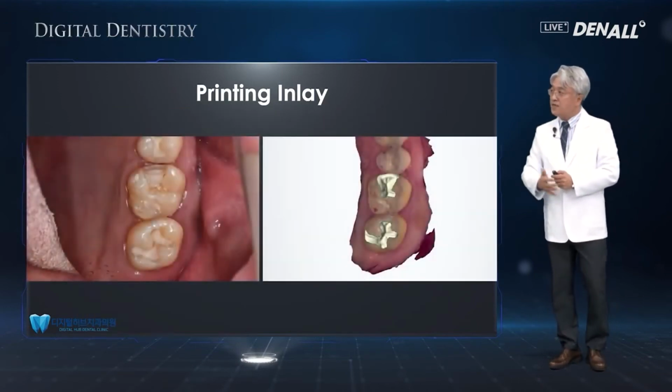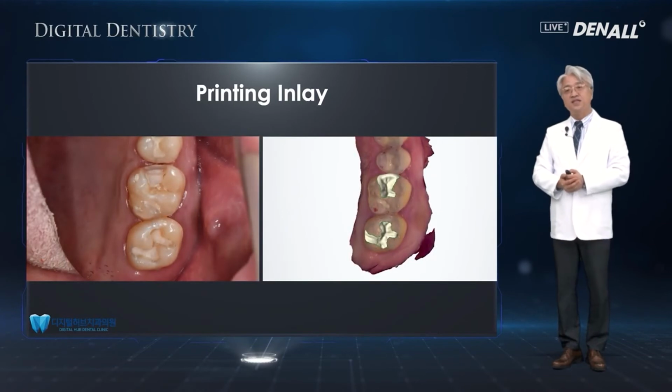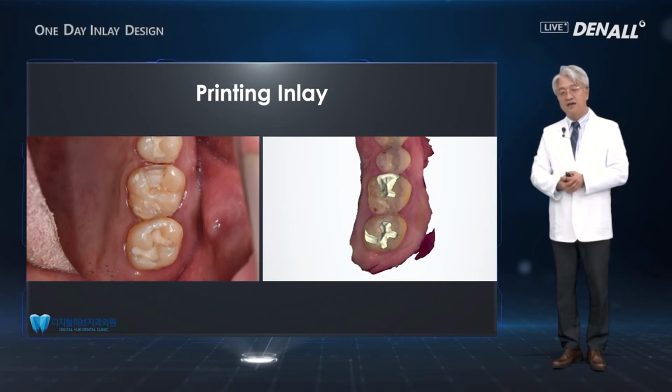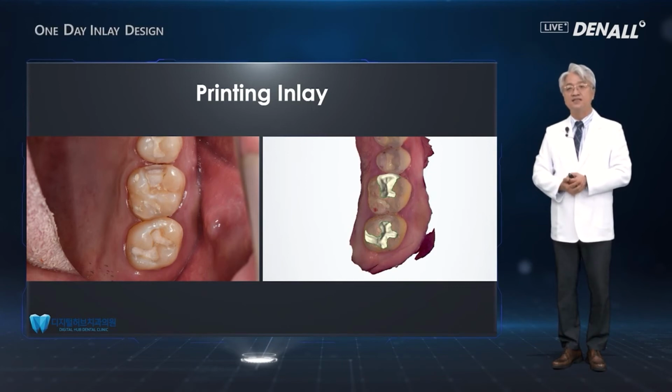Now, let's talk about printing inlay. I think I'm using the printing inlay a lot nowadays clinically, and the final materials are now available with resin and others.